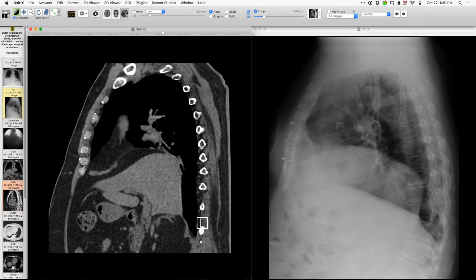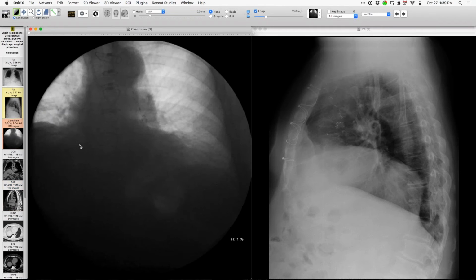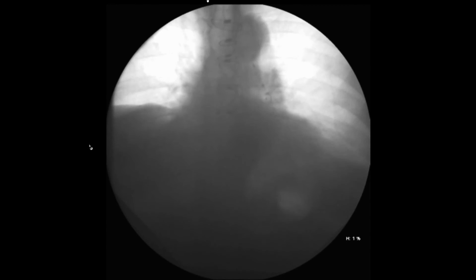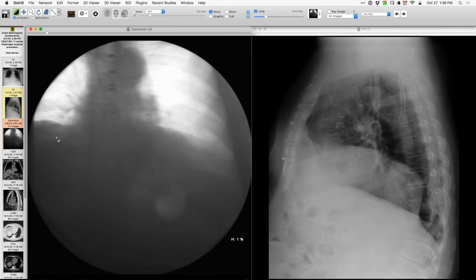Now, I noticed in his clinic notes that they variably describe this as paralysis and as eventration. At some point, a fluoro study was done, but here's the pitfall, I think. If you do a fluoro exam and you only do it in the frontal projection, then you will see findings like paradoxical elevation, as you can see there, with what appears to be a sniff, maybe sniffing several times. So that's what I think the person did and diagnosed paralysis. But the pitfall is if you don't try to fluoro in the lateral projection, you won't be able to perceive that while there's paradoxical elevation of this portion of the diaphragm, this portion here may still move, or at least it won't go up. So that's really a pitfall. This was described on the fluoro as paralysis, but I believe it's an eventration.